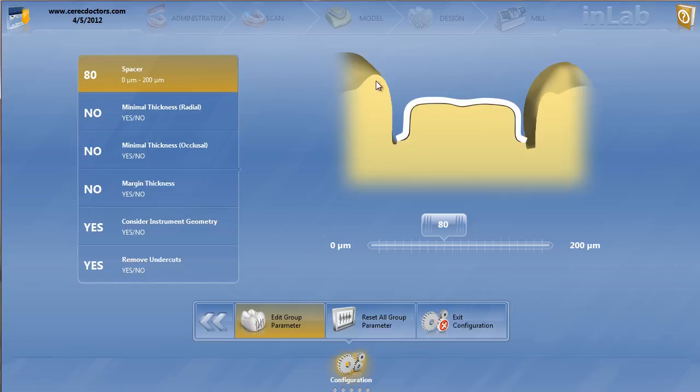And then I'll prep it down and then re-image it to make an overlay in a much more beautiful porcelain, like a Trilux or an Emax HT. So there are applications for us as dentists for the actual framework.